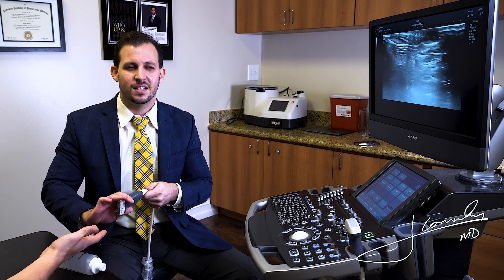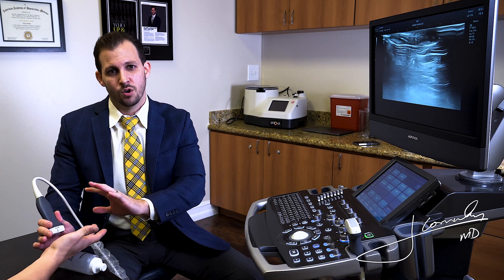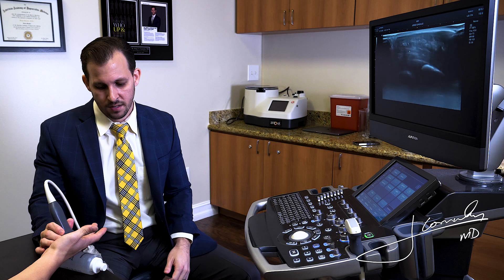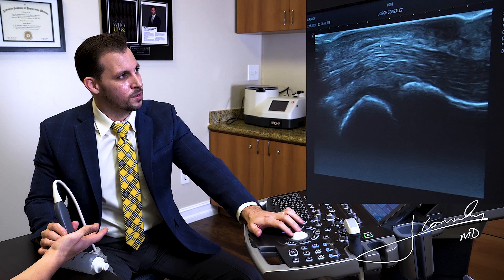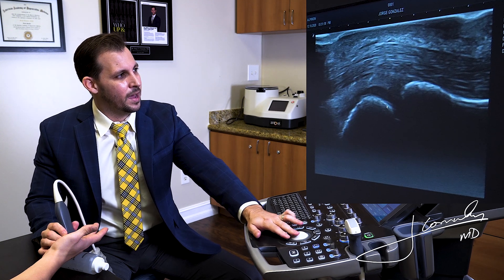We can easily diagnose that objectively with ultrasound in the office, and I'm going to show you what a normal one looks like on ultrasound assessment. The first thing we want to do is visualize our flexor tendons — I've found them right there just for orientation. Top is going to be skin, this is going to be the flexor tendons, and here is going to be my MCP joint.